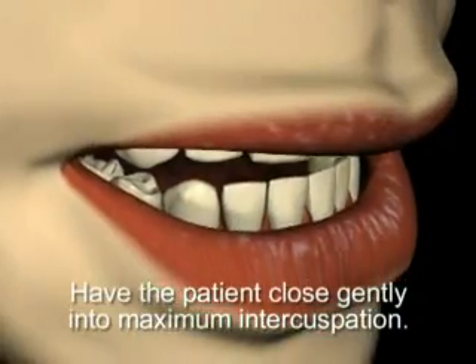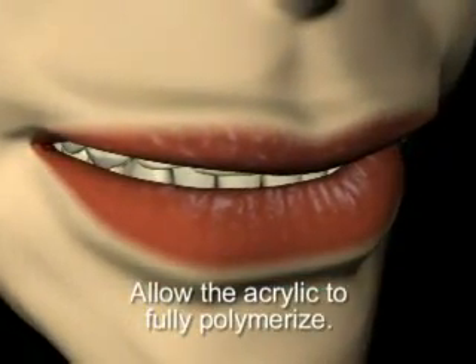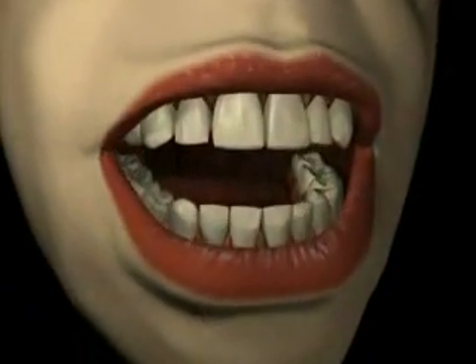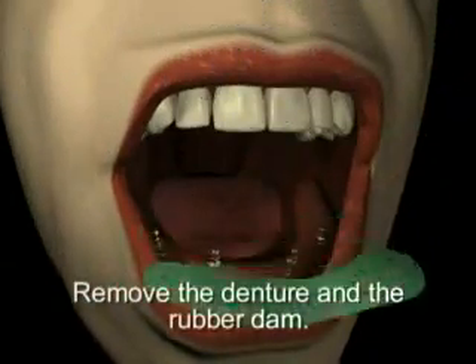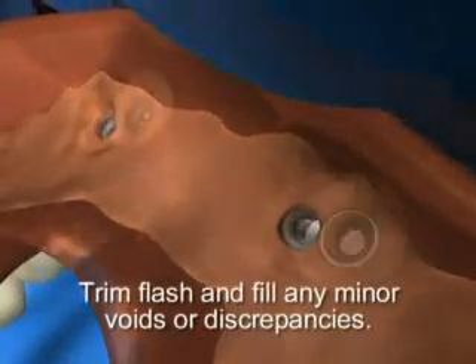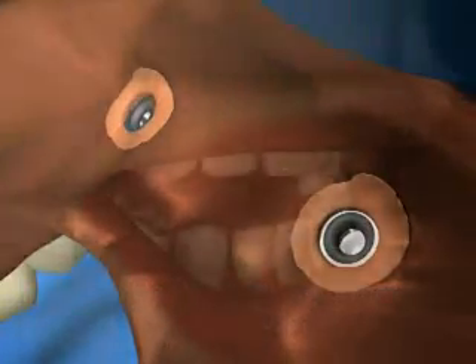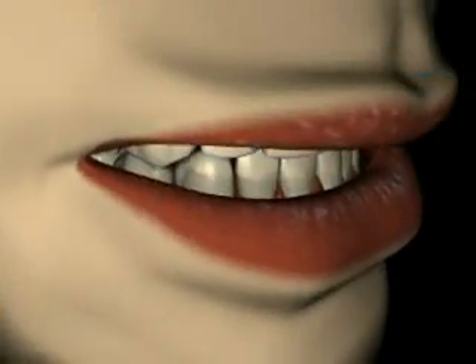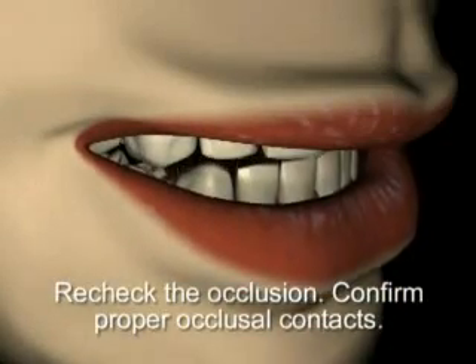Have the patient close gently into maximum intercuspation and allow the acrylic to fully polymerize. After the acrylic has set, remove the denture and rubber dam, trim flash, and fill any minor voids or discrepancies. Ensure that there are no sharp edges on the tissue-bearing surface of the denture. Recheck the occlusion and confirm proper occlusal contacts.